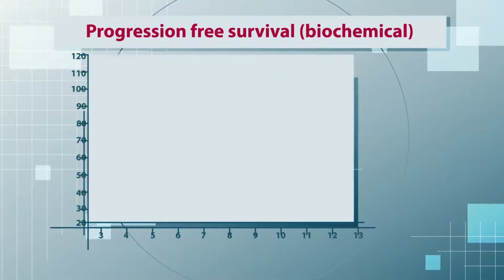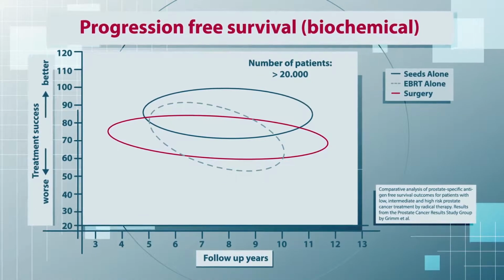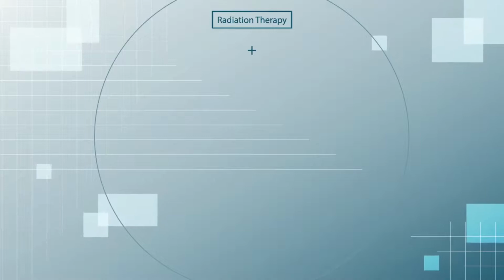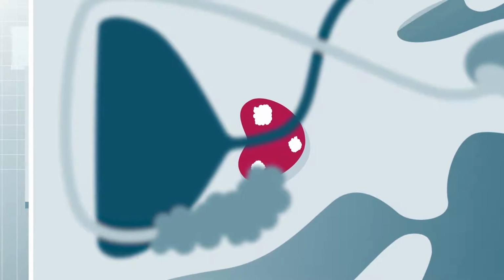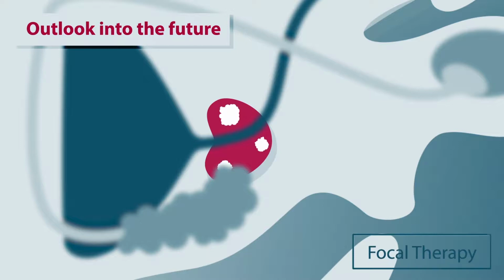Based on the PSA progression, it was possible to determine that a large majority of the treated patients survive without further tumor growth. The findings of the presented study suggest that in terms of the successful treatment of the tumor, brachytherapy provides superior outcomes in comparison to other treatment options. For the higher risk groups, the combination of brachytherapy with external radiation therapy has established itself as the international standard. In view of current and future developments, it is obvious that improved diagnostics will result in a far earlier detection of a prostate tumor and thus allows for the targeted use of radiation. Only the affected area is actively treated and the surrounding tissue without tumor cells is spared.